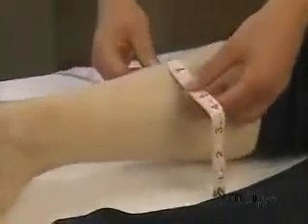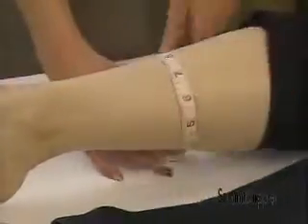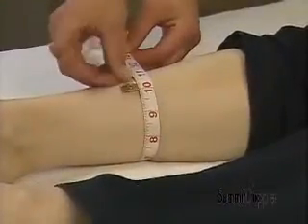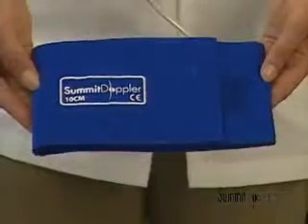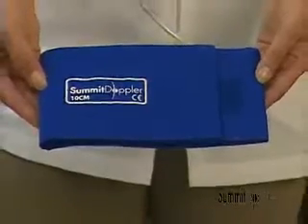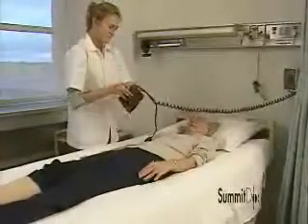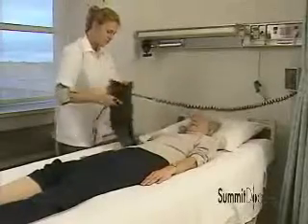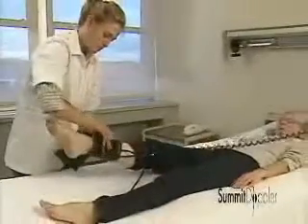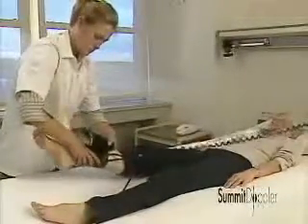It is important to use the proper size pressure cuff. Summit supplies cuffs in 10 cm and 12 cm widths. The proper cuff width is 40% of the patient's limb circumference. For limbs with circumference less than 28 centimeters or 11 inches, use the 10 cm cuff. For larger limbs, select the 12 cm cuff. Most clinicians have found that wall-mounted blood pressure cuffs do not work very well for vascular testing due to the lack of mobility and because multiple cuff sizes are often required.